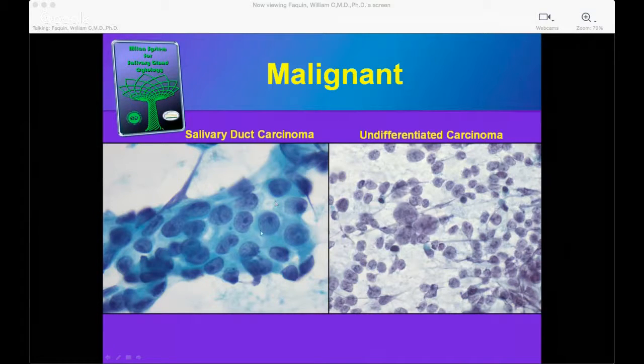At the least, you could call this malignant and high grade, and that's what would be enough to drive the surgical management. If you had material for ancillary studies, of course, like a cell block, you could look for androgen receptor positivity, HER2/neu positivity, p53 positivity to help clinch the diagnosis and give a specific histologic type to this tumor.